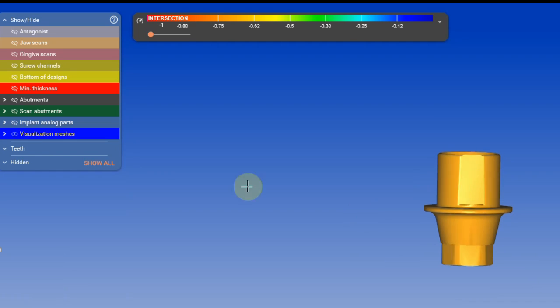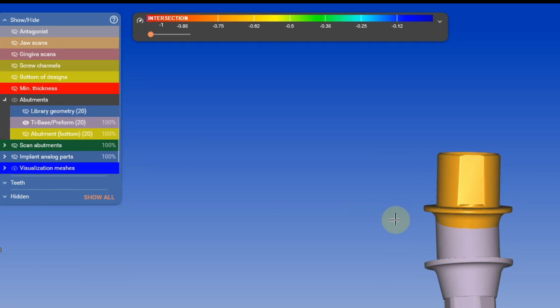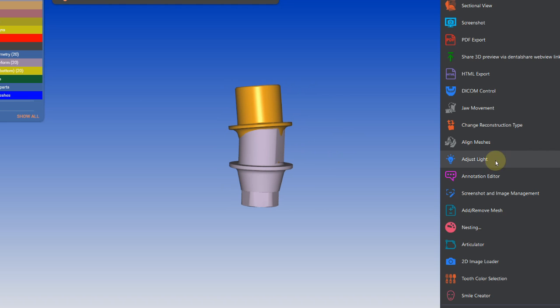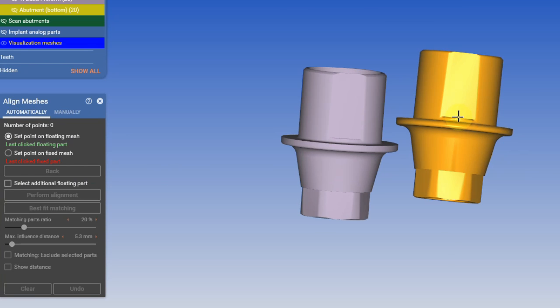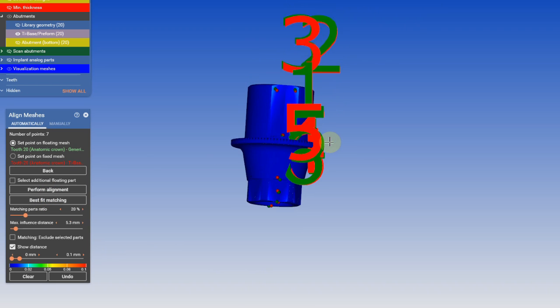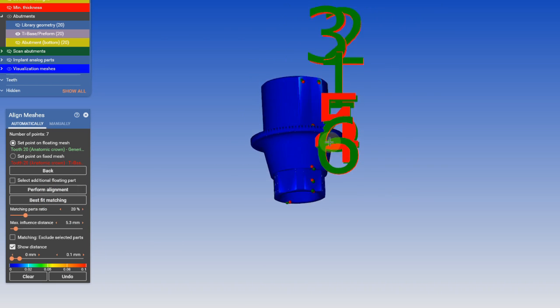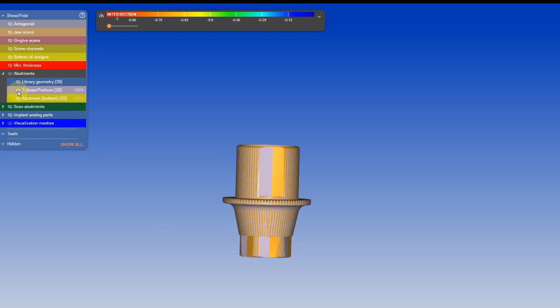After that, I'm going to bring in the library tie base again and align both tie bases. This is a very simple process, and when we align them, it should be completely blue because they're identical files.